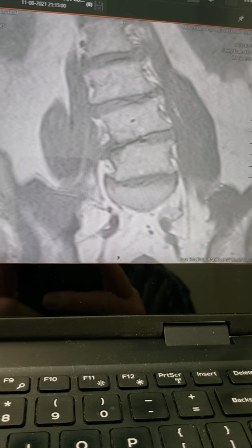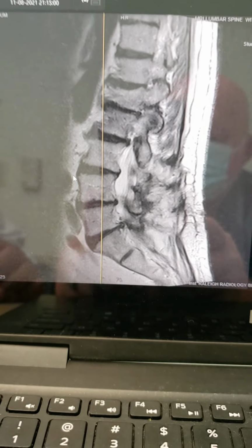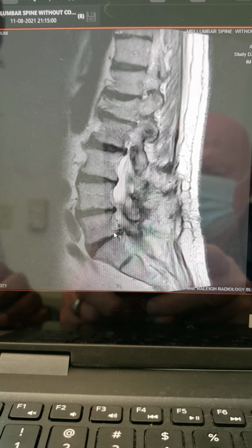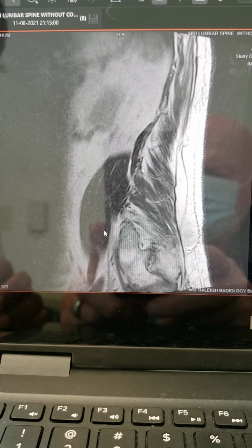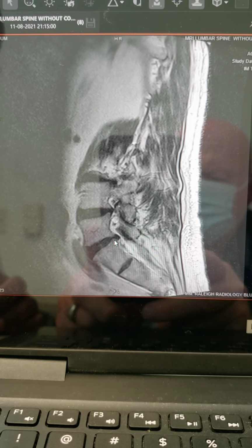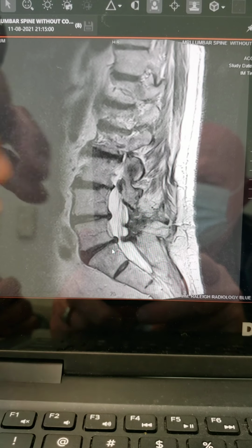And if you look over here, on this side, you see the curvature in the spine. So now we're going to go outside in, working our way from outside to the end. This is the disc down here, the same spot on the left side, and then it goes to the right side.